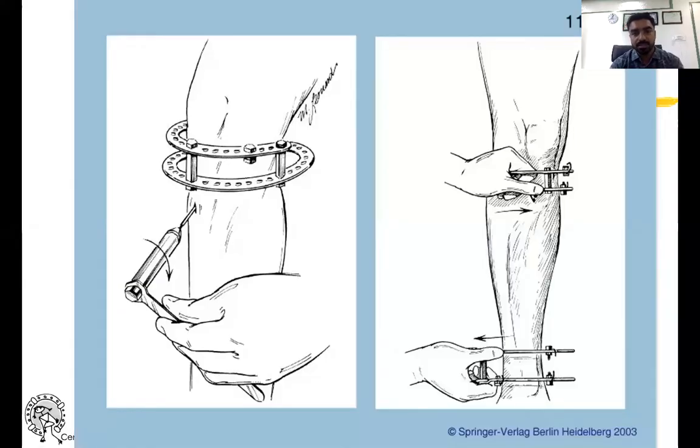Once that is done, we just distract the rod in the opposite direction — we rotate the rings that are fixed to the bone — and get the corticotomy completely done.